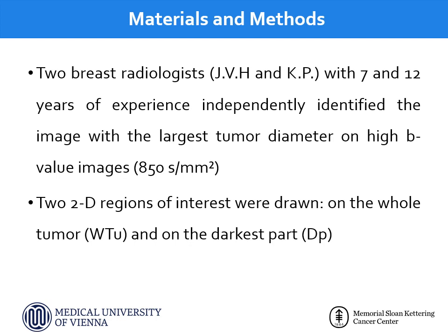Two breast radiologists with 7 and 12 years of experience independently identified the image with the largest tumor diameter on high B-value images. Then, two two-dimensional regions of interest were drawn, one on the whole tumor and another one on the darkest part of the tumor.